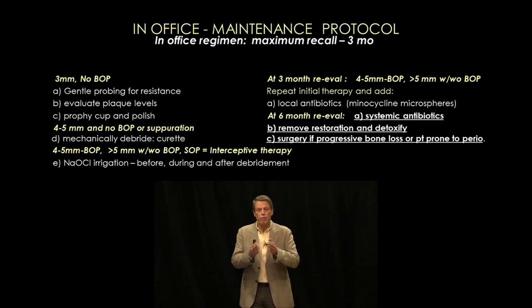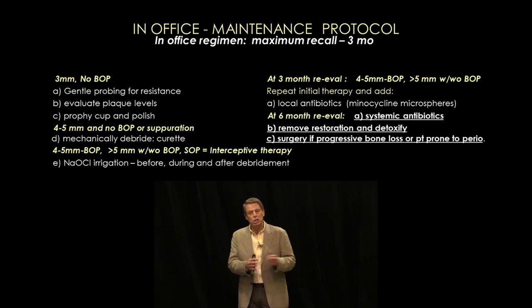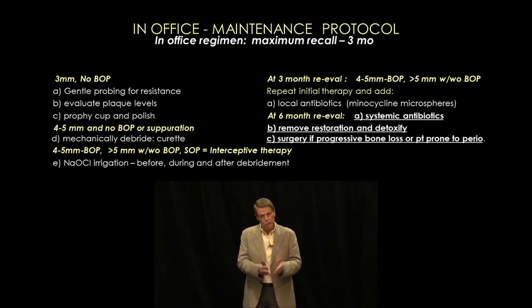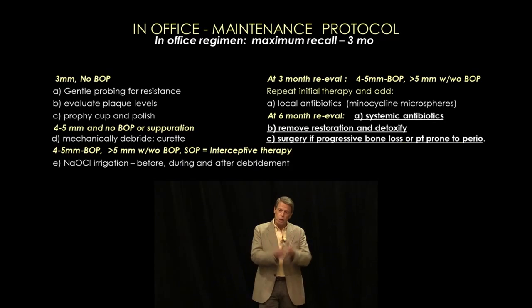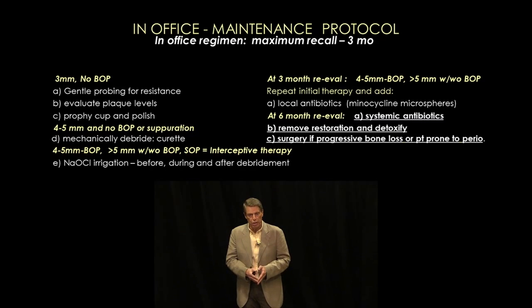We apply pressure for 1 minute continuously right at the gingival margin in order to attempt to get epithelial and connective tissue readherence. Epithelium will readhere to any smooth implant surface or any smooth surface. So what we're doing is cleaning the subgingival area of that implant, and it's a smooth surface, and what we're doing is applying pressure to get epithelial readherence.